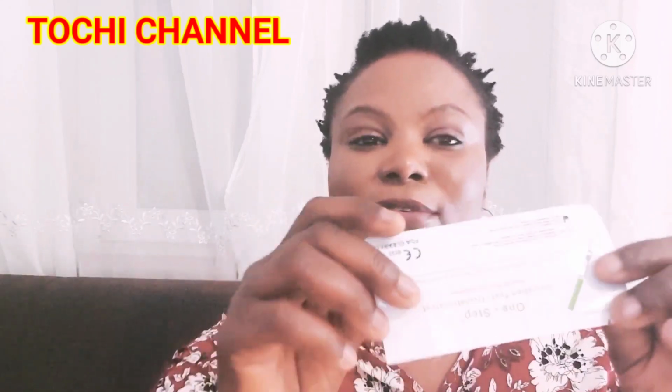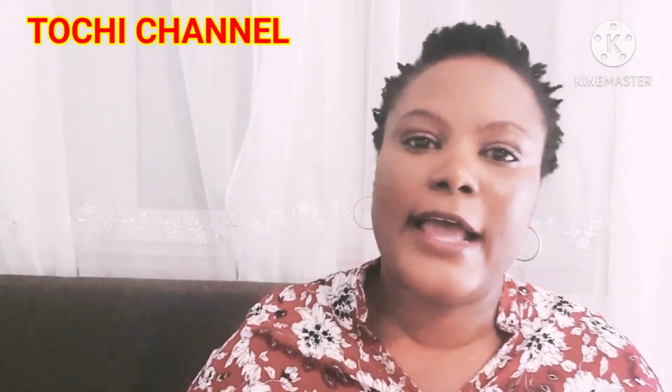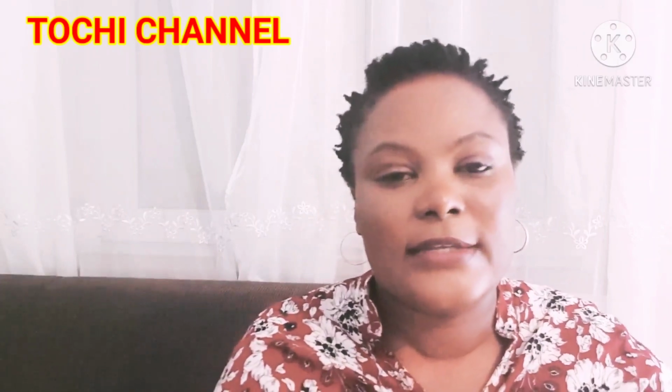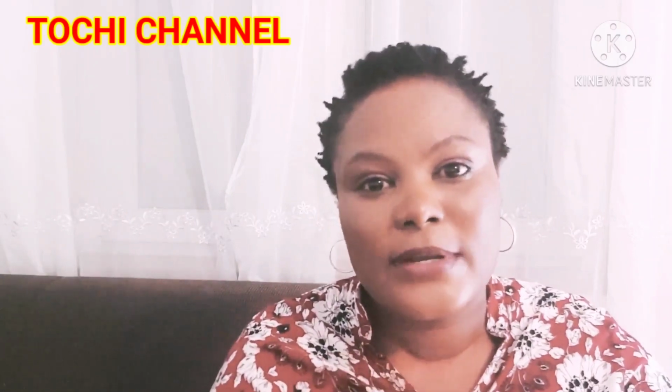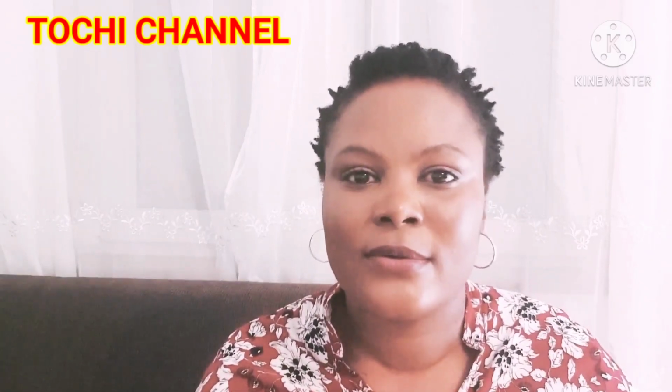So this is the ovulation prediction kit. It is a one-step ovulation prediction kit. I am going to be showing you how to use this. And before I continue, I want to say something. Before you can start using this prediction kit, you need to know your cycle.